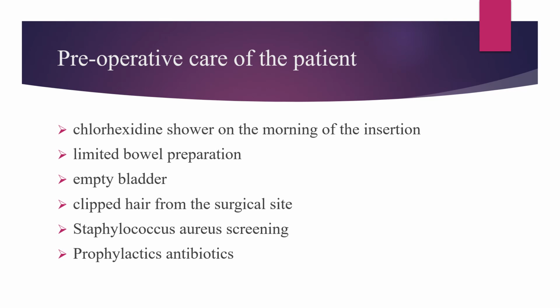The preoperative care of the patient includes, but is not limited to, the following: the patient needs to take a chlorhexidine shower on the morning of the insertion, empty the bowel and bladder, have hair clipped from the surgical site, do bacteria screening, and take antibiotics for high risk of infection.